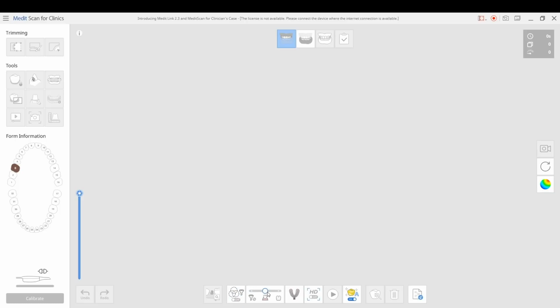Next to this filter, based on how good your graphics card is, basically what you're trying to do when you're imaging is balance the amount of information that's coming in with good data, and you want to avoid picking up data that you don't need. The tongue that's moving, you don't need for an intraoral scan, so you can use a variety of things like a rubber dam or an Isolite or your fingers, and use these filters to weed out things that you don't want.